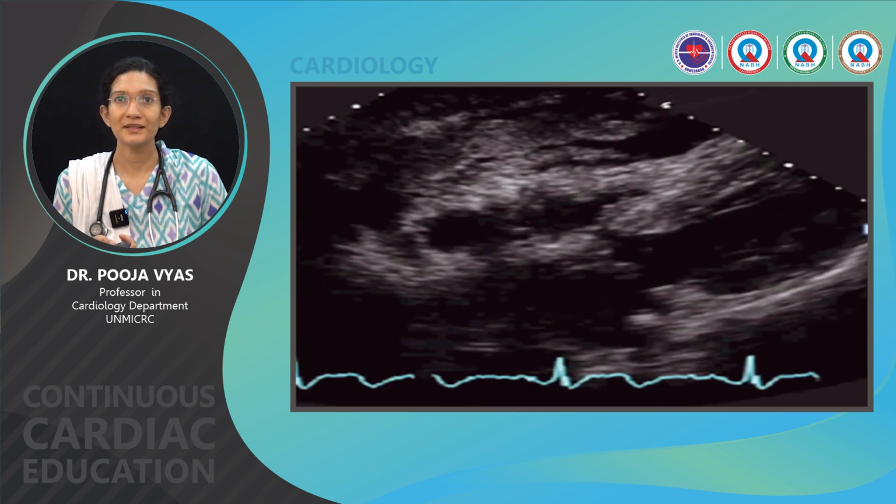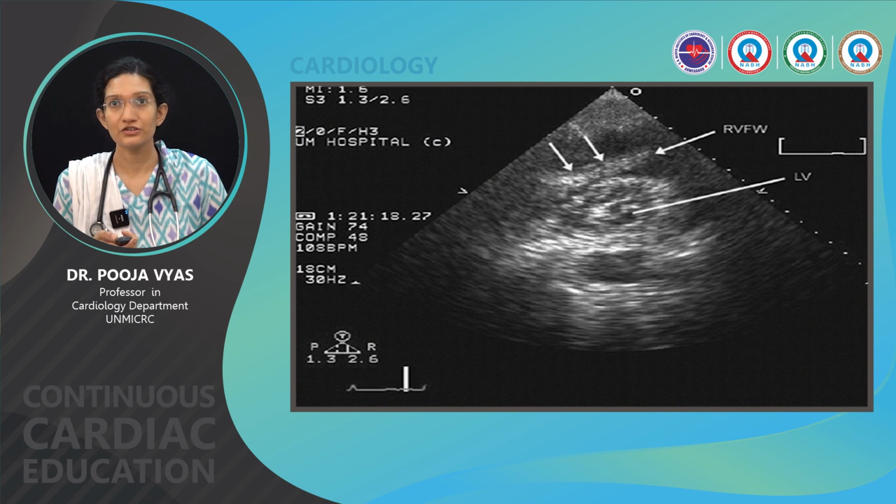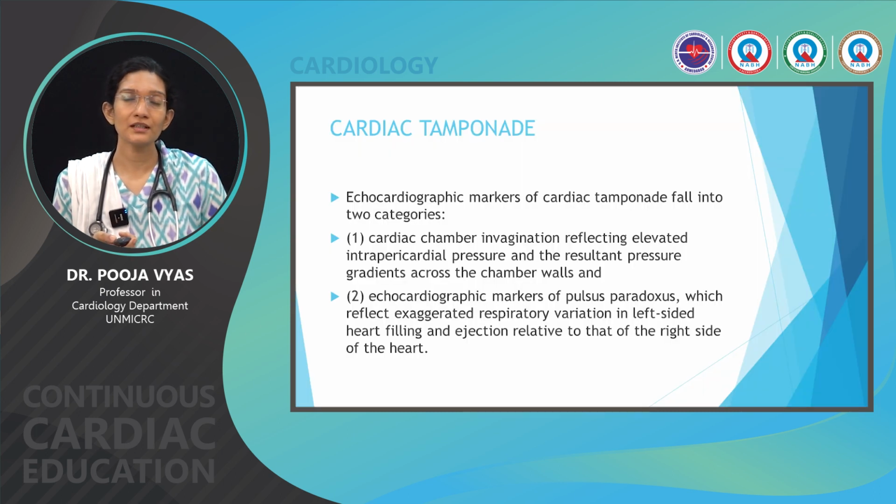So, this is an image showing hematoma towards the right side of the heart, and possibly there is a right ventricular free wall rupture, and we can see that the hematoma is sealing that place. Again an image showing hematoma within the pericardial cavity. Hemodynamic consequences of pericardial effusion can also be diagnosed echocardiographically. So, we can diagnose definitely on echocardiography when the patient develops cardiac tamponade.